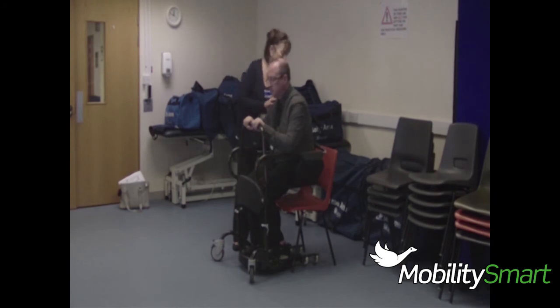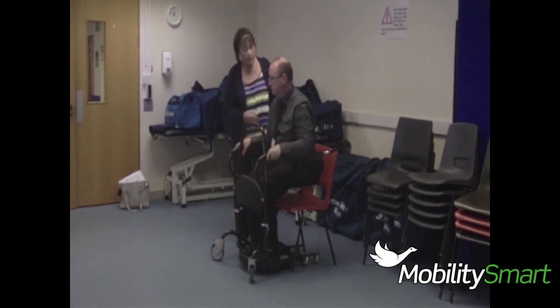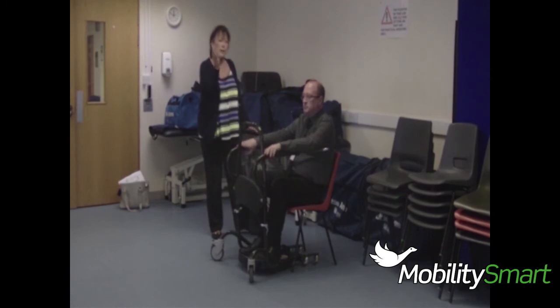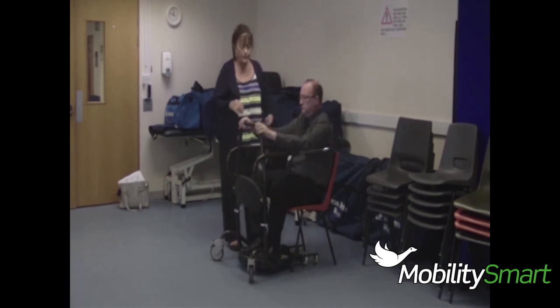I'm going to remove the back pads. Now, I want you to imagine that you're tired. It's the end of the day, and you can't stand right up. Okay. So what may be easier to do is to bring your hands down onto these side bars. I just want you to push your bottom up a couple of inches as though you can't stand right up. That's fine. Down you go. So you don't have to achieve a full stand. You can, and that's what we want you to do, of course, but you don't have to.